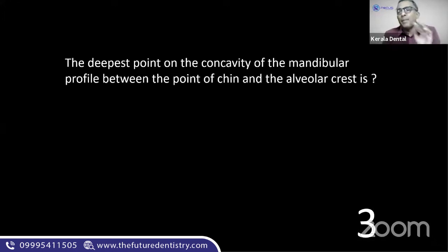Deepest point, come to the chat box, guys. Deepest point on the concavity of the mandibular profile between the point of chin and the alveolar crest. Sujay Singh just said A. Are you serious, Dr. Sujay? Mandibular profile. Mandible is B. Mandible is never A. A is maxilla, Dr. Sujay. Are you here? Are you listening to me, Dr. Sujay? Show me a thumbs up. I can see you. Do you understand what I mean?